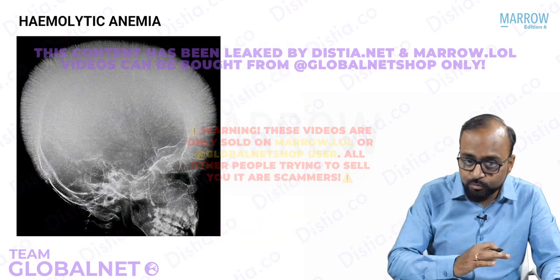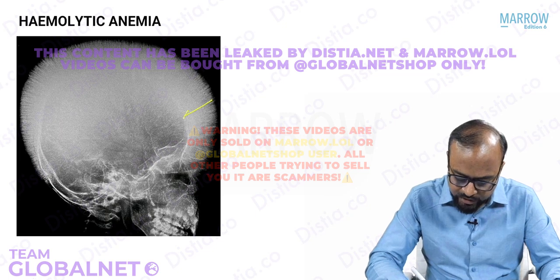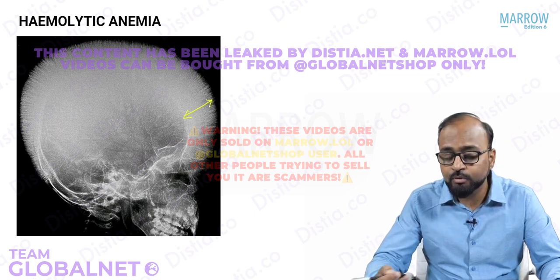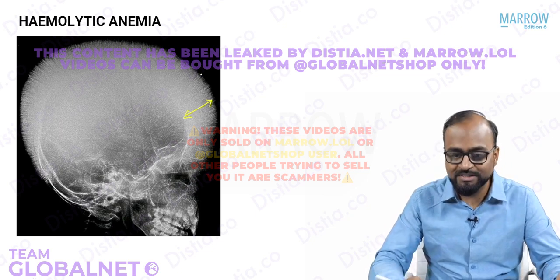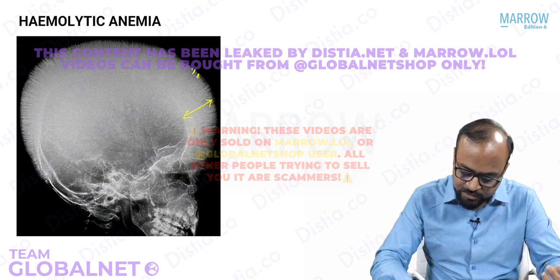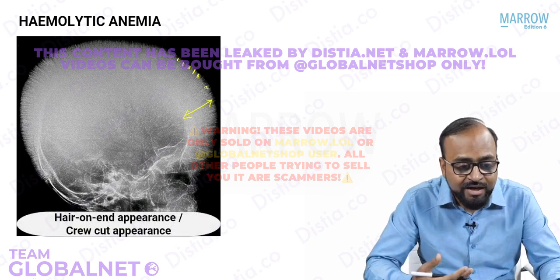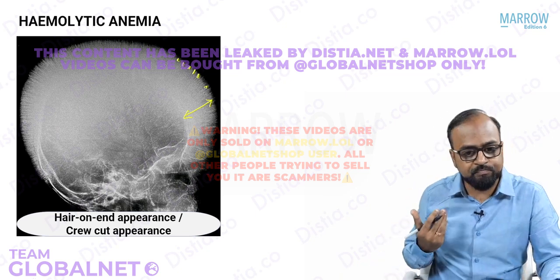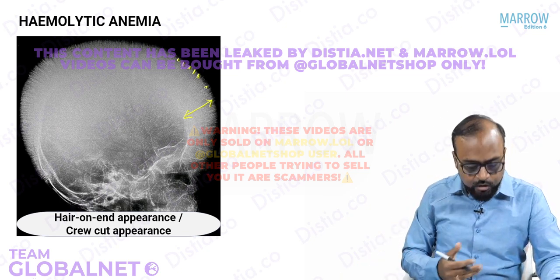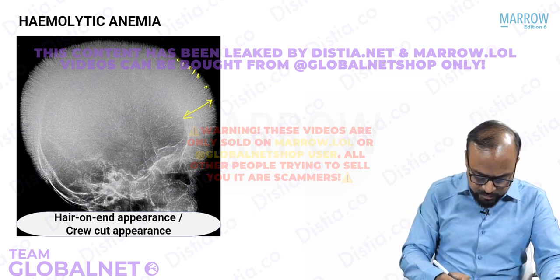Now see here, in hemolytic anemia, as we have discussed, this appearance when we started with, there is widening of diploic spaces. Why? Because the marrow is trying to compensate for the hemolysis. So there is expansion of diploic spaces, and there are these multiple spurs, so the trabeculae become thickened. This is called the hair on end appearance or crew cut appearance. It is mainly seen in hemolytic anemias, remember.